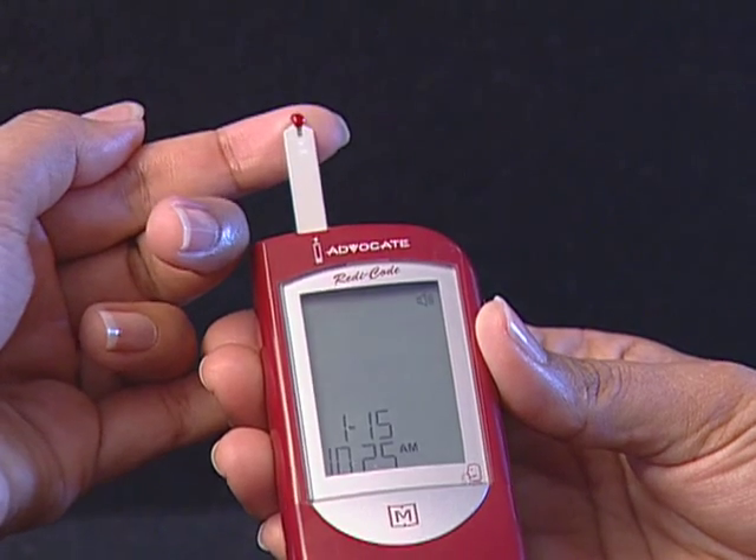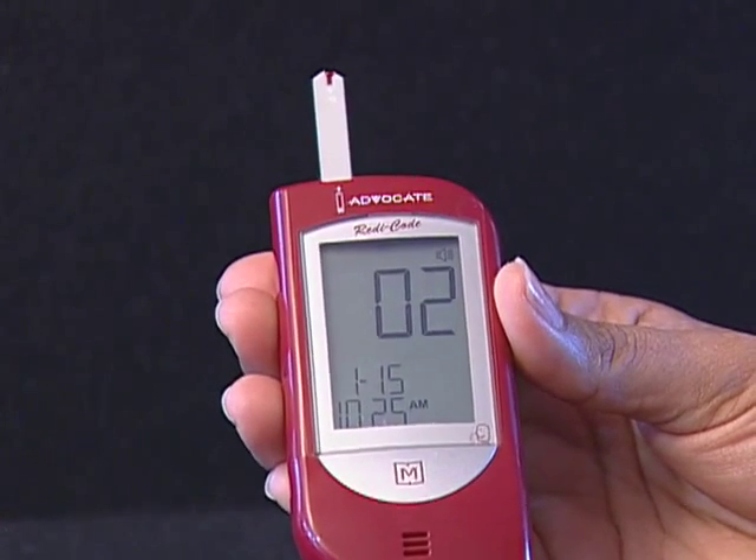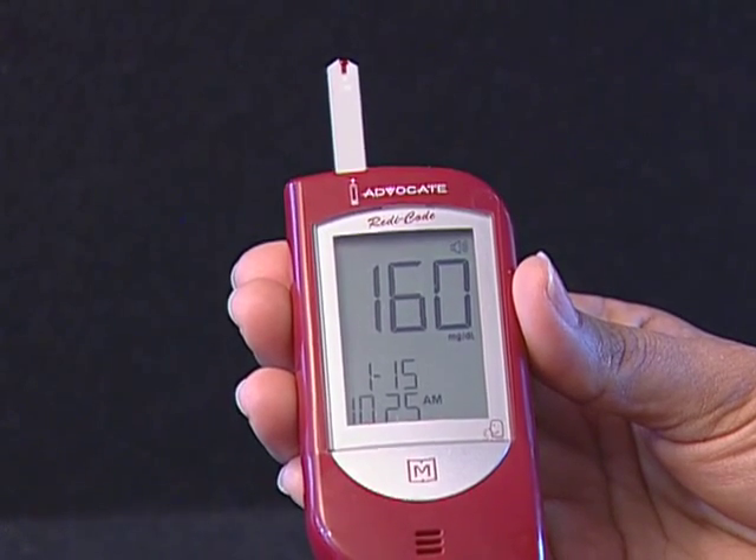Step 5: Obtain an accurate test result in 7 seconds. The result of your blood glucose test is shown after the meter counts to 0. This reading is automatically stored in the meter.